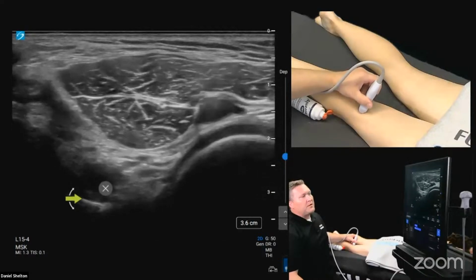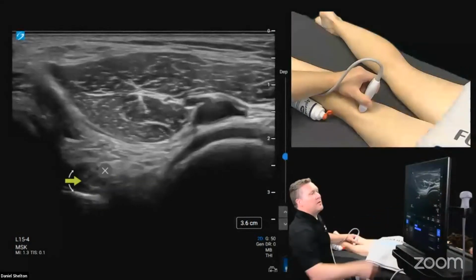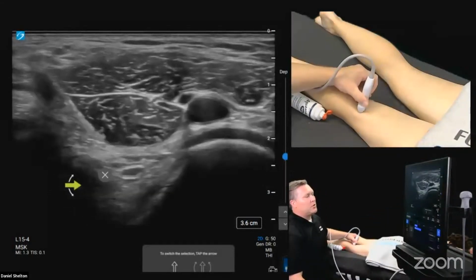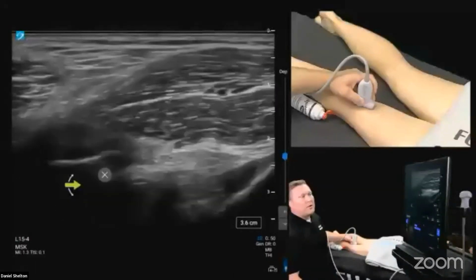Ligaments are more dense, so they're more subject to anisotropic artifact or angle artifact, if you're new to this. And you can make this look like a cyst just by having the wrong angle. So always check your work, check your angles, okay? So that's kind of a little bonus PCL for joining the webinar with us today.